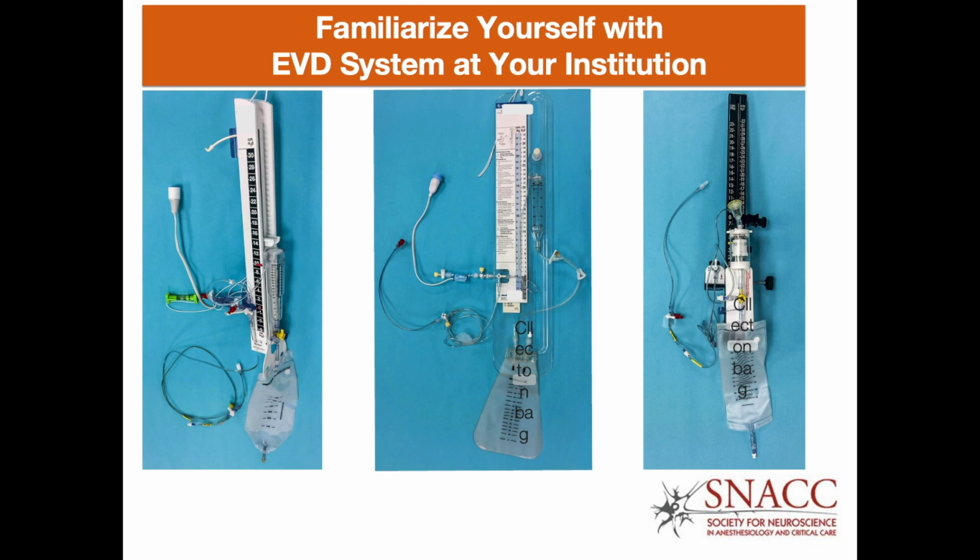As with the EVD catheters themselves, there are a number of different collecting systems. It's important to familiarize yourself with your institution's type, as there are several that have components that are disposable and non-disposable, and you'll need to ensure that you inquire about both the consumable portion and non-consumable portion of the collecting system. Some collecting systems have gradations for millimeters of mercury and centimeters of water, whereas others can limit the amount of hourly CSF withdrawal. So it's important to familiarize yourself, as there are many differences in these collecting systems.